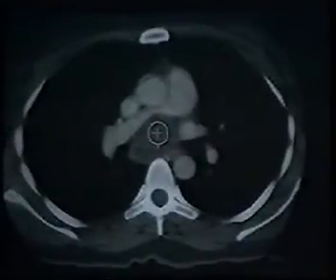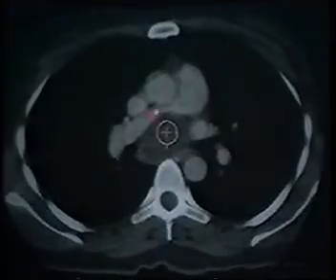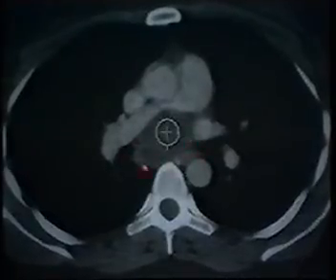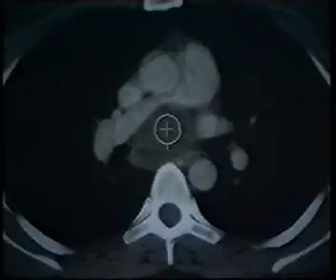The reason why this particular patient had so much decrease in the perfusion and ventilation of the right lung is shown in the corresponding CT bolus study. We can see the typical appearance of a non-enhancing, fluid-containing subcarinal mass, which is clearly compressing the right pulmonary artery just at its origin. Why was the MR signal intensity on the T1 weighted sequence intermediate? Well, because this is what this fluid looked like when it was in fact aspirated. This is not clear serous fluid, but in fact contains old clotted blood within. And that's an important realization.